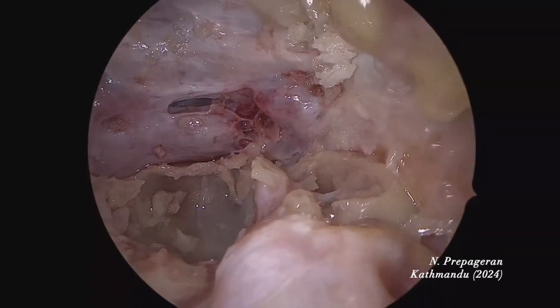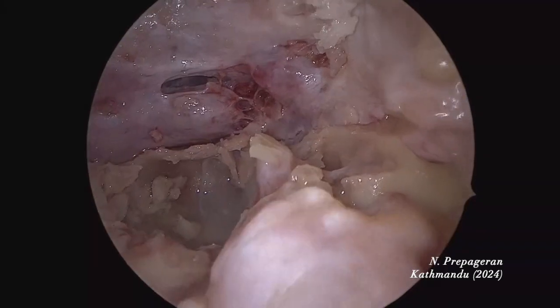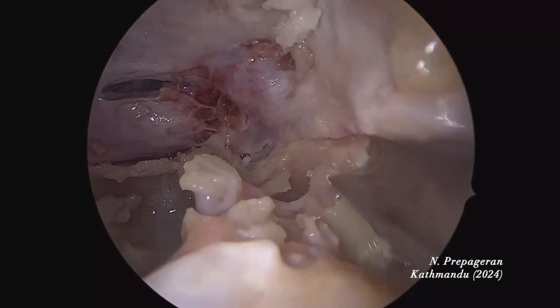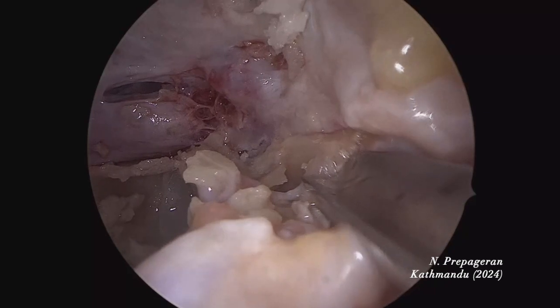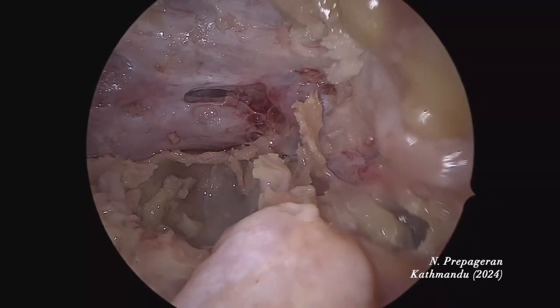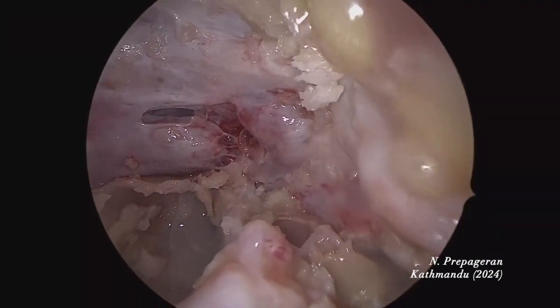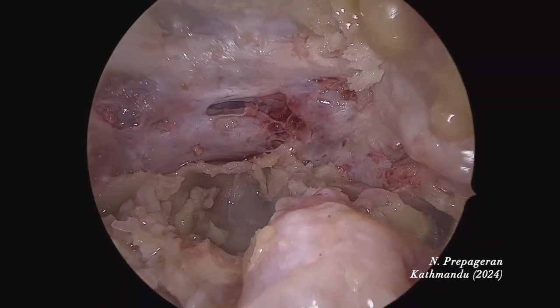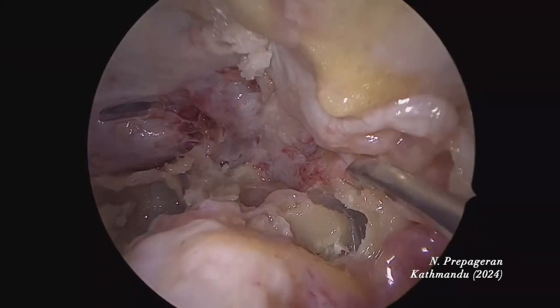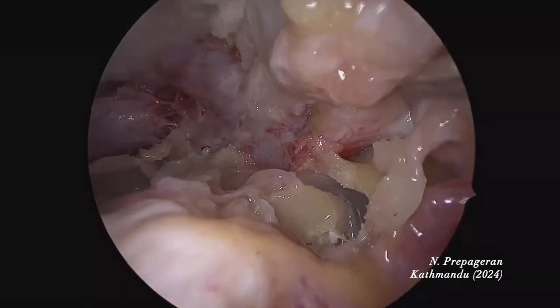Here is the foramen — foramen rotundum. Can you see? I've exposed the nerve along the foramen rotundum here. Follow it back — this is V2, this is V1. Above foramen rotundum you have the maxillary strut. This is your orbital fissure. This is V1, V2, and V3 would be down here. Now we're going to go to the clivus. I don't want to open the dura until everything is exposed — I want you to have a view of the anatomy with the dura intact.